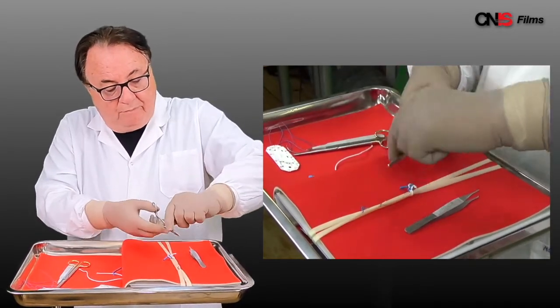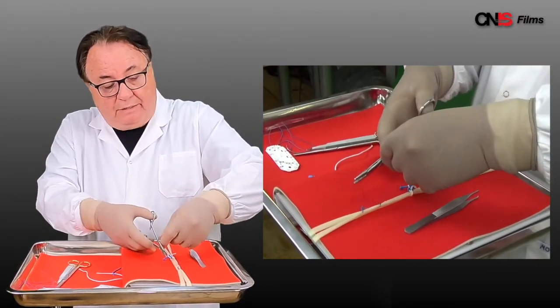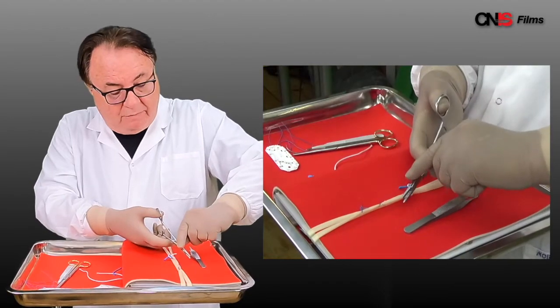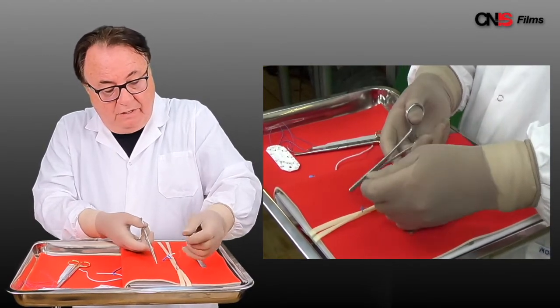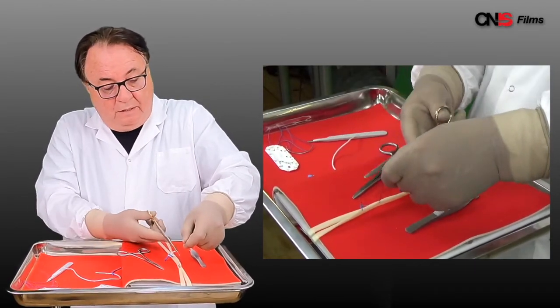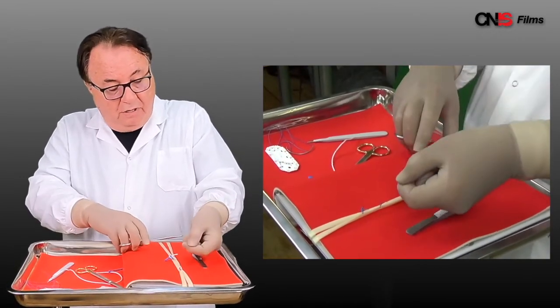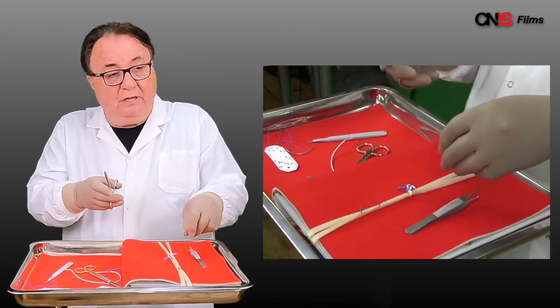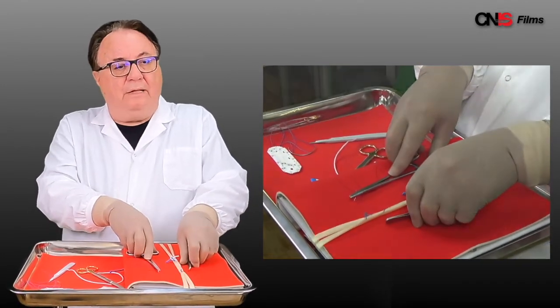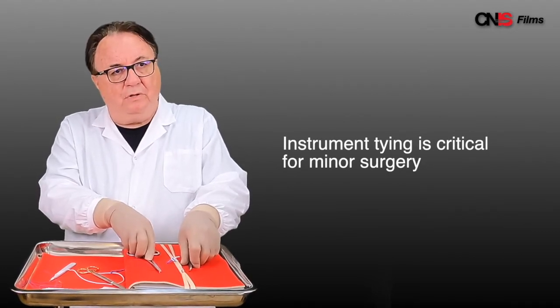So this is your instrument tie. A lot of people find it easy to do; a lot of people don't do it right. The major mistake they make is that they don't keep their instrument inside the V. If you keep your instrument inside the V and you cross your hands, you will get a square knot which will be secure. A knot that's not secure is dangerous for the patient's life. A knot that's secure promotes healing and allows the patient to survive your procedure. Instrument tying is critical for minor surgery. If you can do that, you're ready to do procedures, and that's what will happen in Lesson 4 and 5.